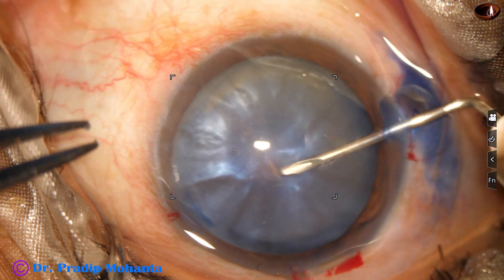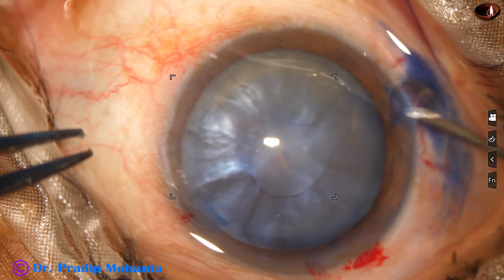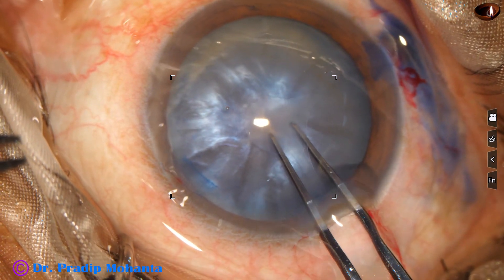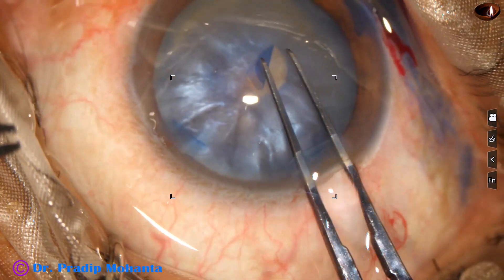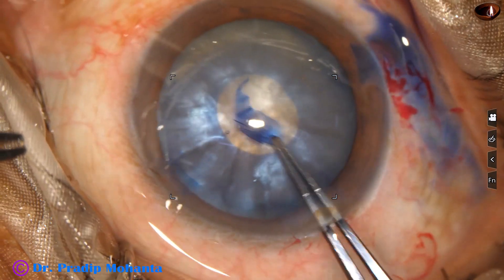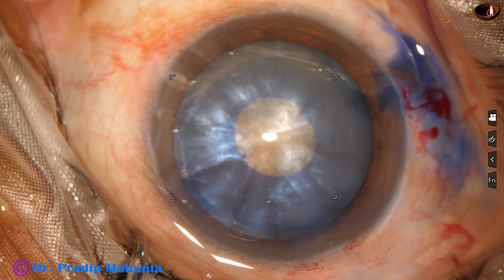Going through the 8 o'clock side port, make a puncture at the center and make a C-flap. Take the Utrata forceps to convert this C-flap into a small rhexis — a mini-rhexis.